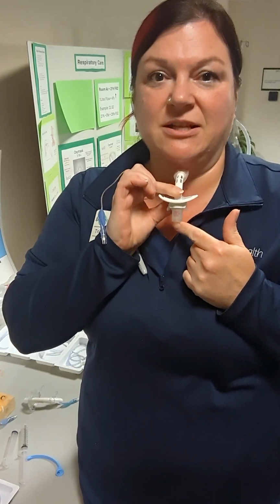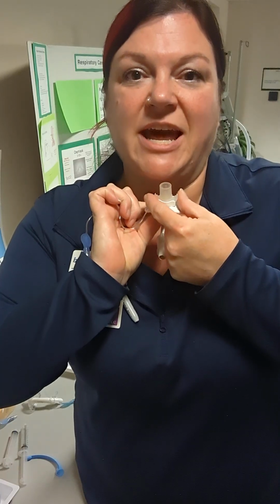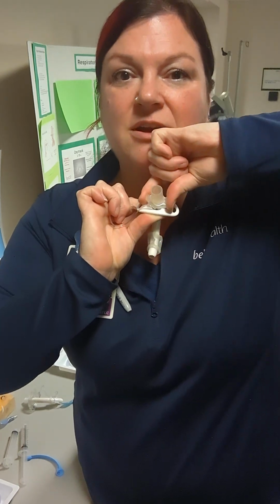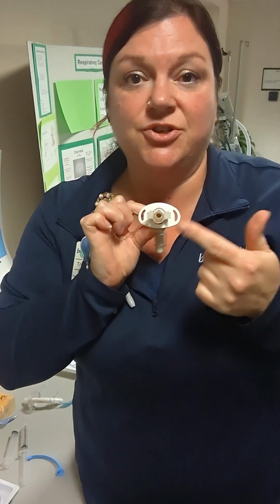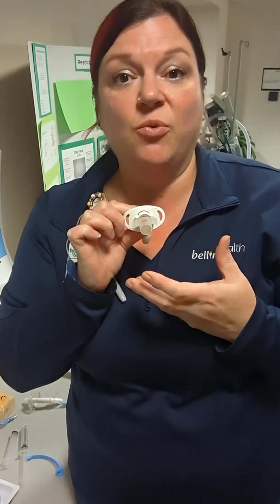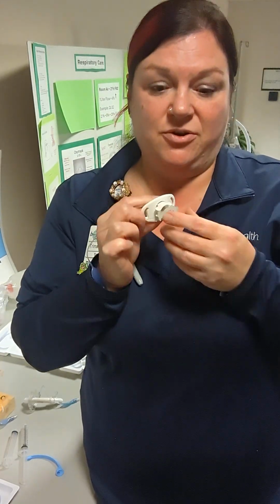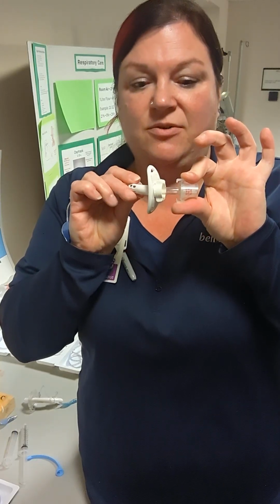Now this type is a little bit trickier. I'm trying to get the right angle because of these clasps. They're like little angel wings, and we need to pinch them together to get it to snap onto the front of this flange. Now, if you've never used one of these and you would like to handle one, I have extras. So just talk to your educator and I can drop them off for you to handle. But essentially, you're going to pinch these little angel wings and it snaps right in there.